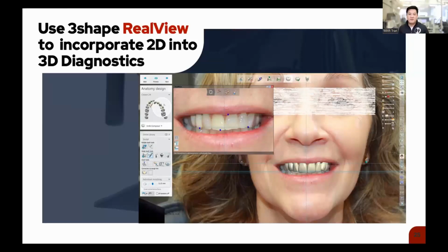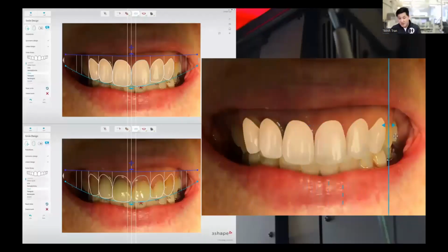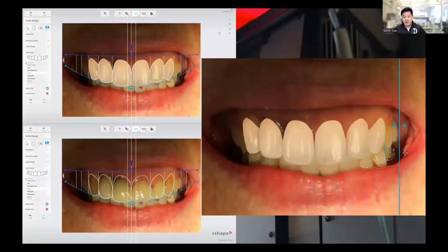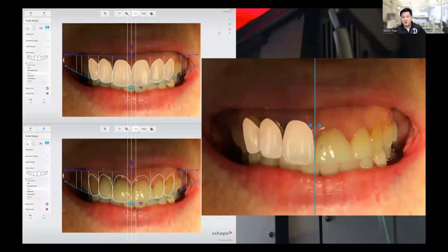There's a little bit of back and forth there, and I'll show you a case where we did that. So in this example here, we had a patient. The doctor determined that she's definitely going to need crown lengthening, right? And I looked at the DSD, the digital smile design, and I said the same thing. So of course, we present her with a 2D smile design, and the patient goes, okay, I like the way that looks. So of course, the next step is to refer to a periodontist, in this case, because the doctor just felt more comfortable with that.